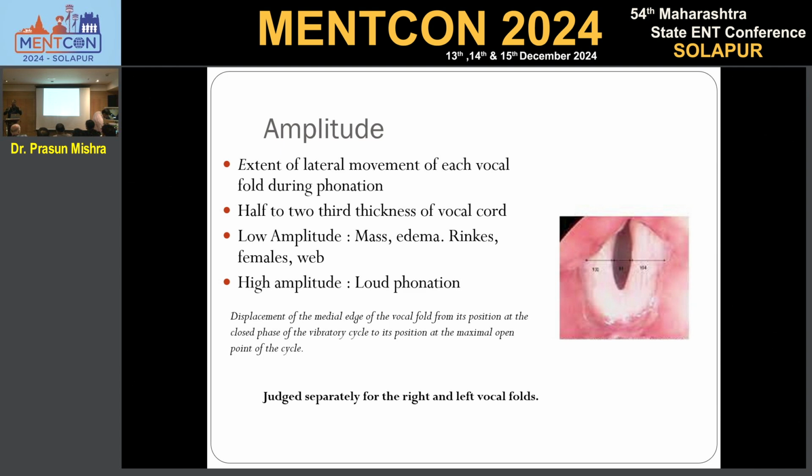And the important point is, when you have this system, you record the voice at high pitch, low pitch, and up-and-down pitch, and in all the movements look for these five things that we see inside.